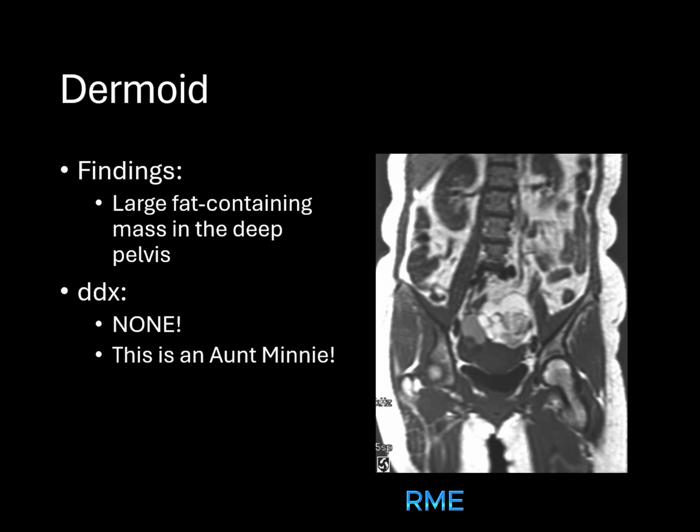There are no differential diagnoses here. It's an aunt minnie. To further evaluate, an MRI can help confirm the diagnosis and assess the extent of the lesion. Management typically involves surgical excision to prevent complications such as rupture or malignant transformation. Let's move to the next case.